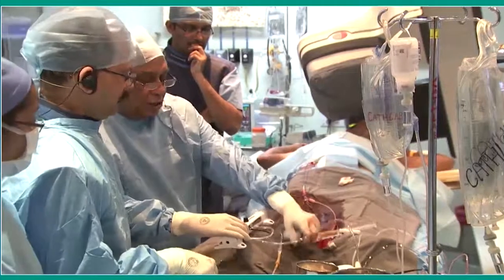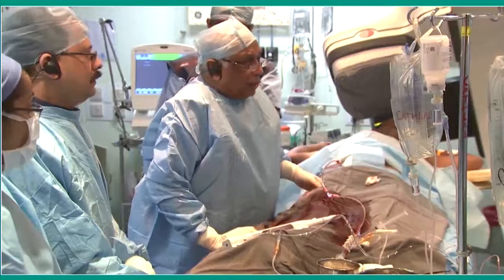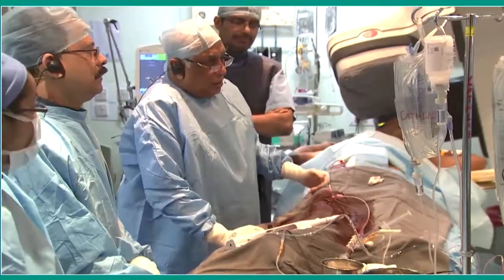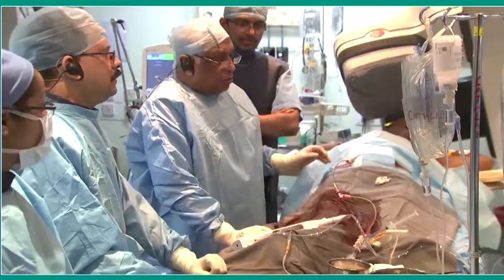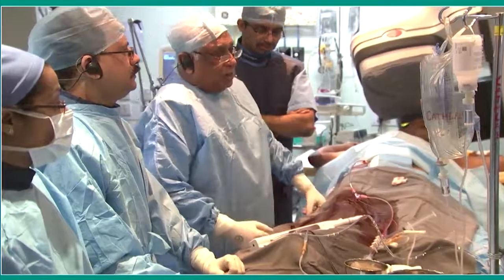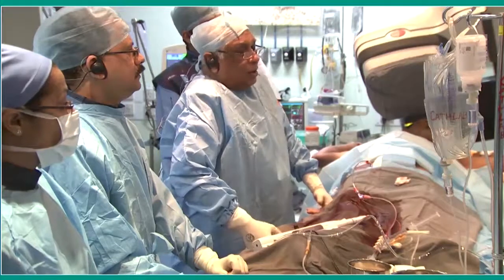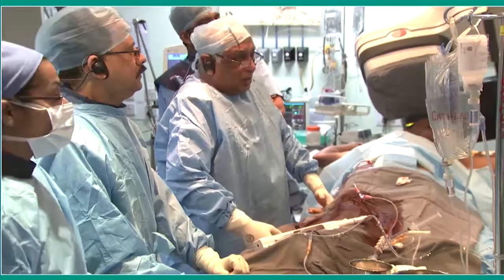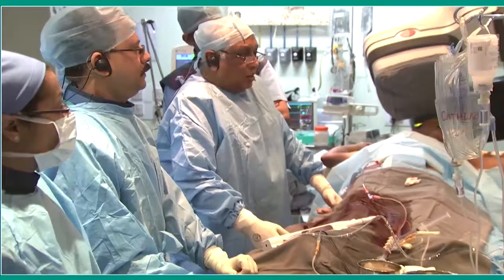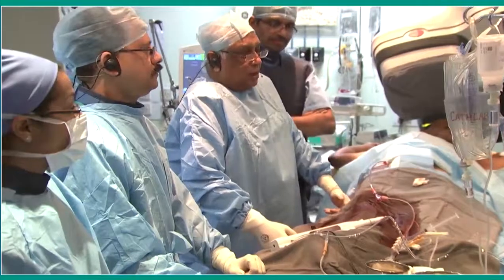What I intend to use is probably an Alpine stent, and I'll use an AngioSculpt balloon to properly prepare the lesion. Why do I intend to use these two devices? Because the AngioSculpt will give us a much better lesion preparation. It will cut through the calcium and we'll get a good bed to deliver the stent. In this tortuous, long, calcified lesion, the Alpine stent is so much more low profile and trackable. That will do the job well.